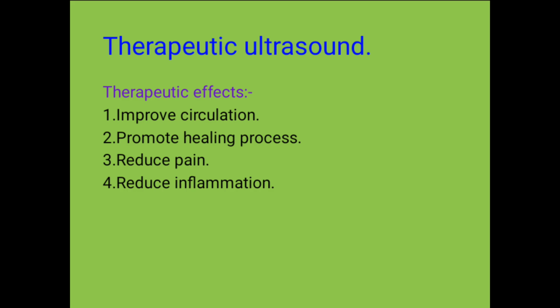Again, it will reduce pain and reduce inflammation. On the reduction of inflammation, it will increase the lymphatic flow. This lymphatic flow will help move accumulated fluids away from a joint. That is generally about the reduction of inflammation.